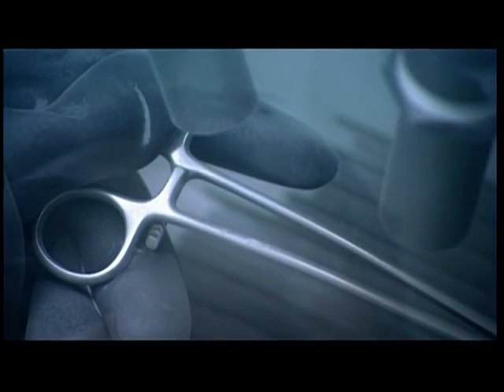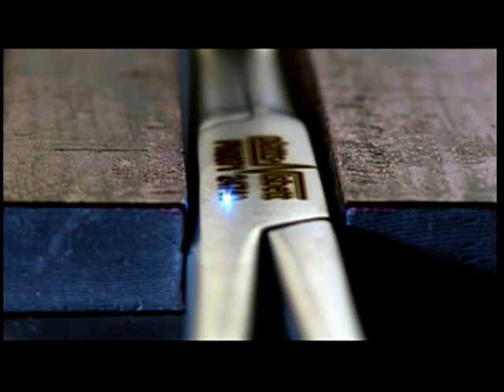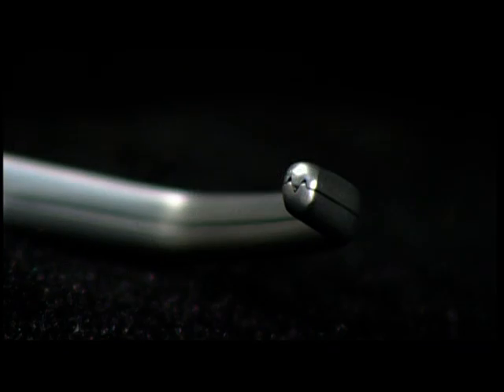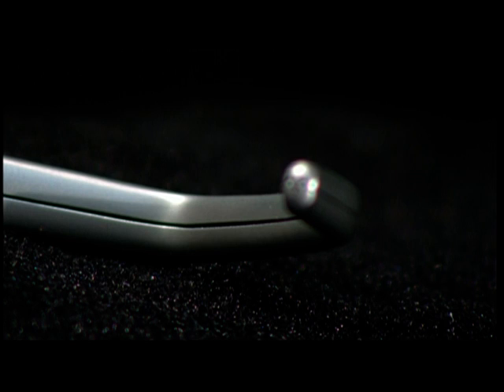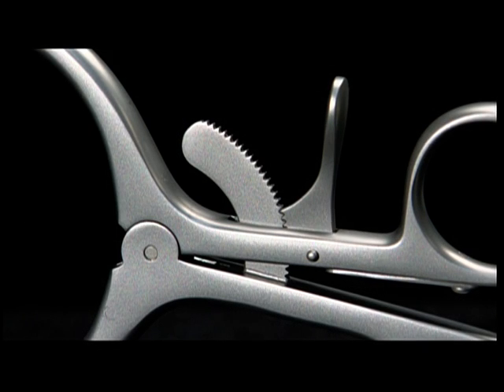After heat treatment to strengthen the metal, they blast it with fine glass particles to give it a satin finish. They laser etch the company name and identifying numbers onto the surgical clamp. The numbers will allow the tool to be traced back to a particular production run. And now it's ready to take its place on the front lines of healthcare.